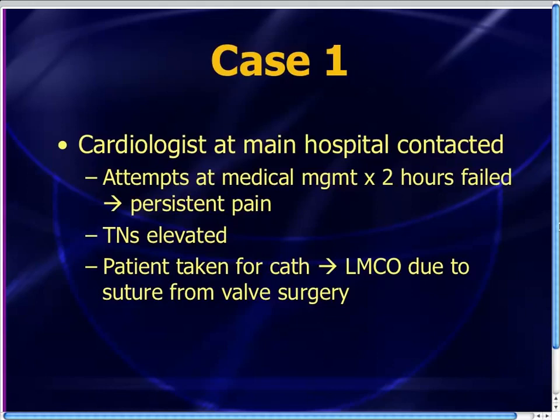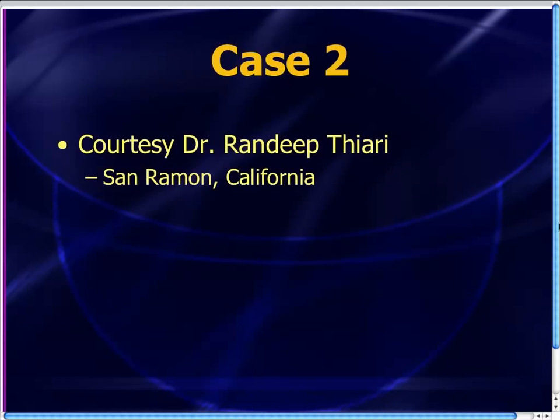So the patient ended up surviving, and that's a life saved because Andrew knew how to read that 12-lead EKG with a little bit more than just basic knowledge. Next case, sent very recently by Dr. Randeep Tiwari. He works in San Ramon, California, and recently finished residency at SUNY Upstate. So for those of you at Upstate, kudos to you for training this outstanding young physician.